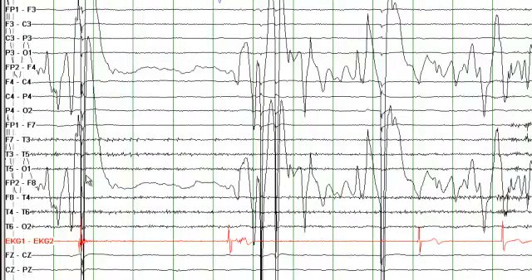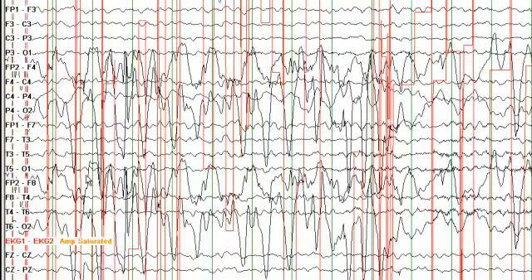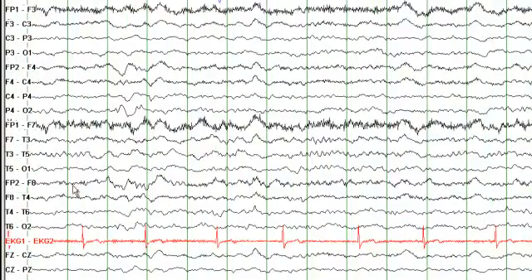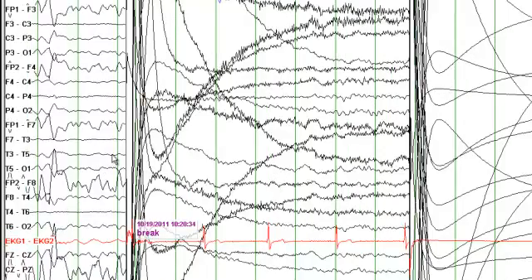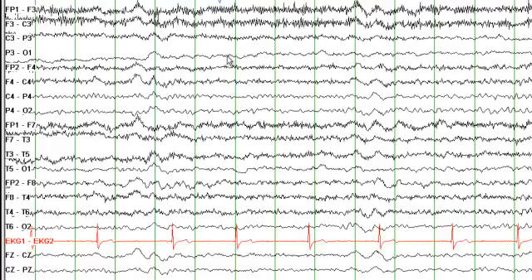I'll give you just a few more seconds to write your impressions, and we are about to go to the beginning of the record and review the EEG. So let's start here — you do see some alpha rhythm. Counting across one second: 1, 2, 3, 4, 5, 6, 7, 8 — almost 8 Hz. You can see it in C4-P4, not always necessary to see it in P4-O2. On the left side it is not as well formed. You see a lot of theta frequencies in the background, electrode artifact, muscle artifact, and delta frequencies.